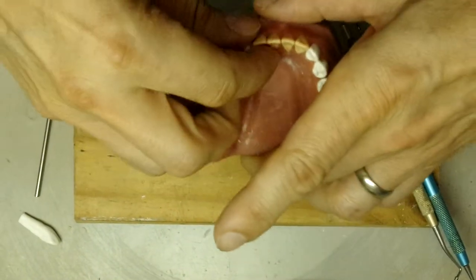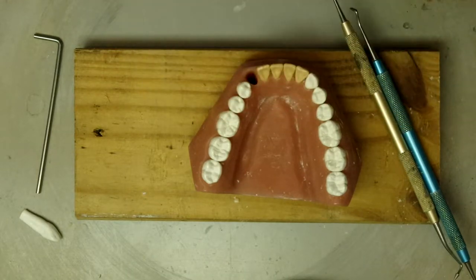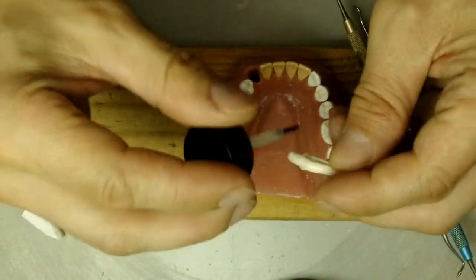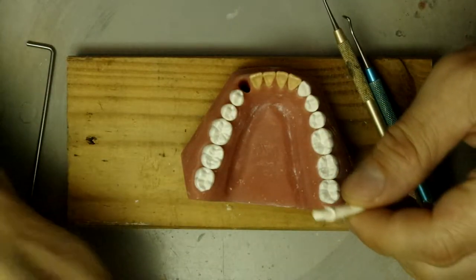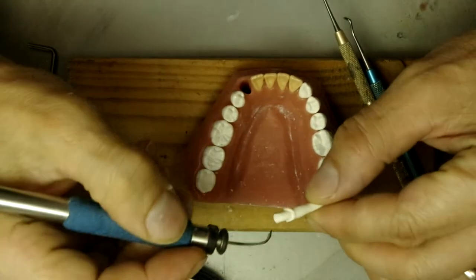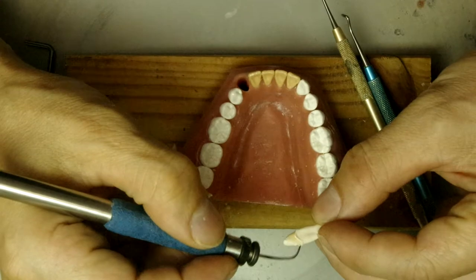Put on a little bit of lube. Make sure it's not the hardener, it's the lube. Just a little bit. We always start with a wax coping.